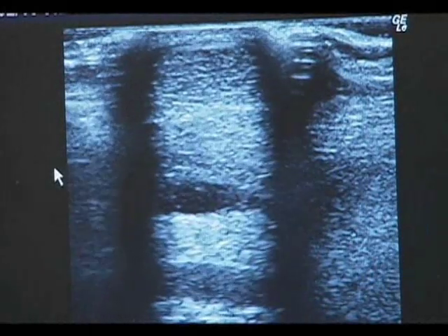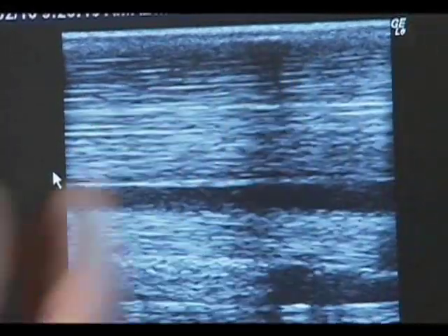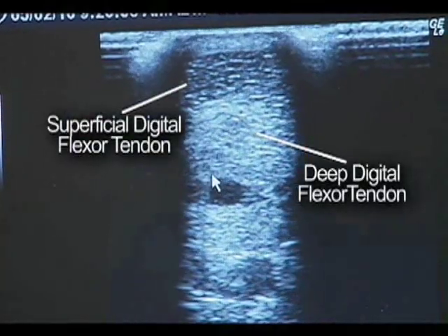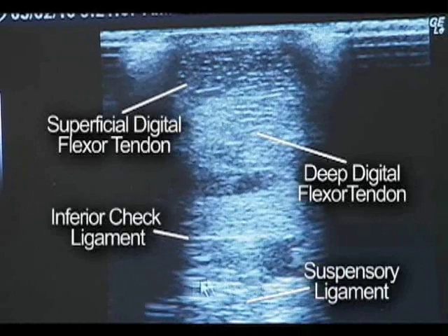So right now we're looking at it sliced like a loaf of bread. And then if we rotate the probe 90 degrees, we can look at them from the top of the leg to the bottom of the leg. This is the superficial digital flexor tendon right there, the deep digital flexor tendon right there, the inferior check ligament there, and furthest away from the skin, this is the suspensory ligament here.